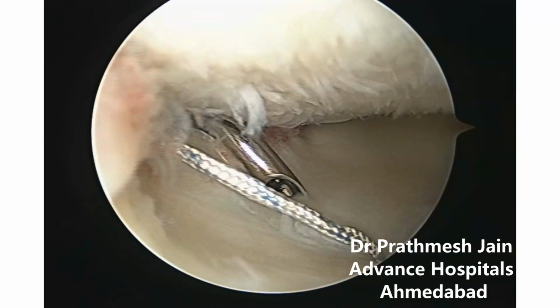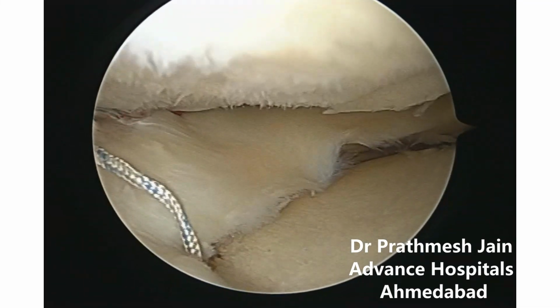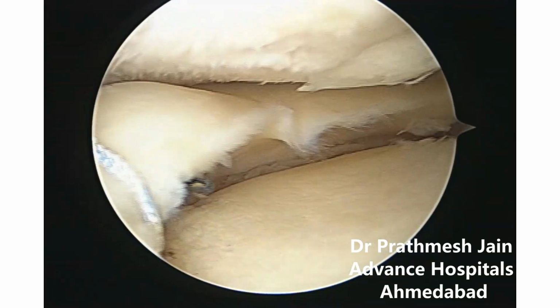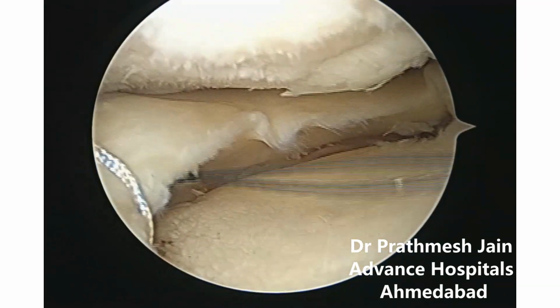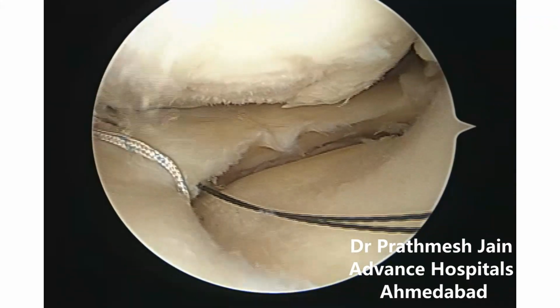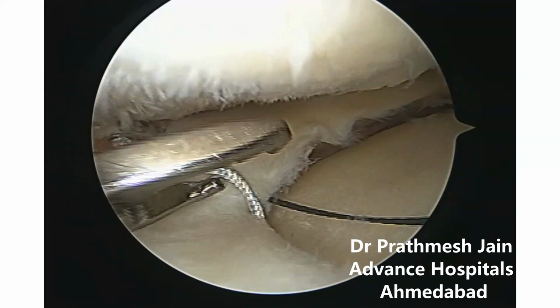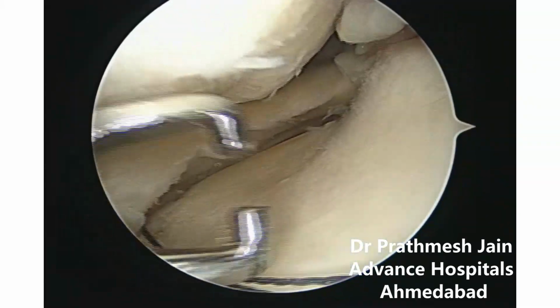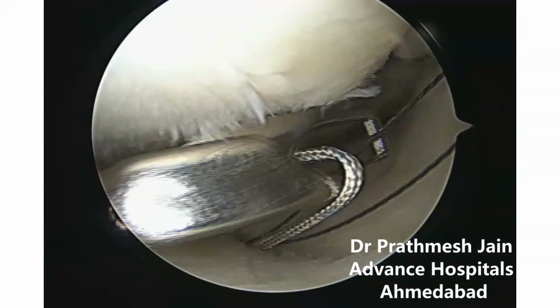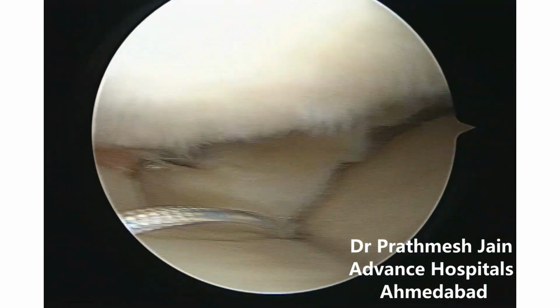This is the second suture, and usually this is at the junction of the middle 1/3 and the anterior 1/3. So we want to reduce that part which is avulsed from the meniscus rim attachment, back to where it was on the tibia. The other thing that it does is it covers the chondral defect. So the chondral defect which is exposed will now be covered with the meniscal tissue, and hereby it will be protective for the meniscus.